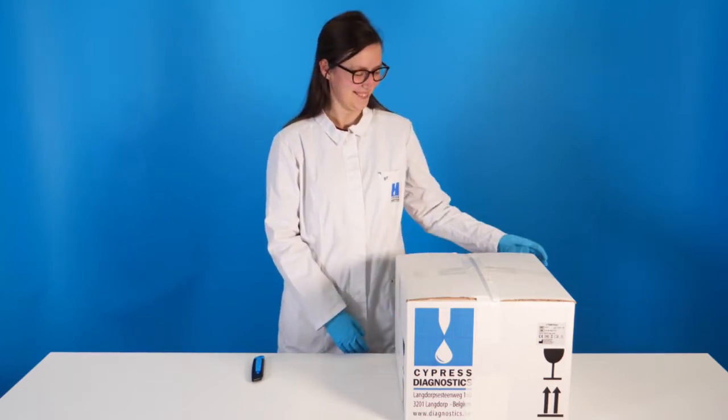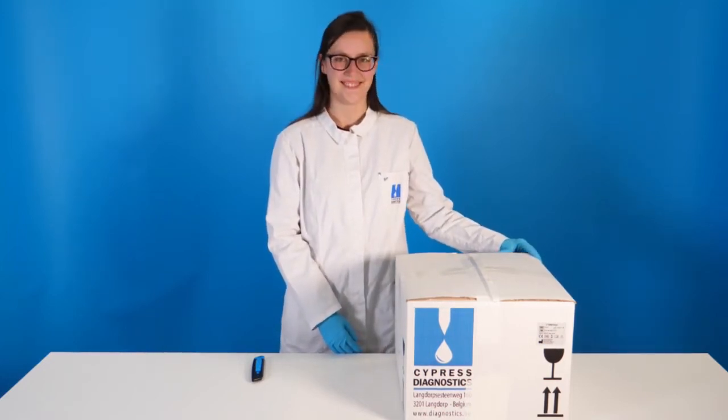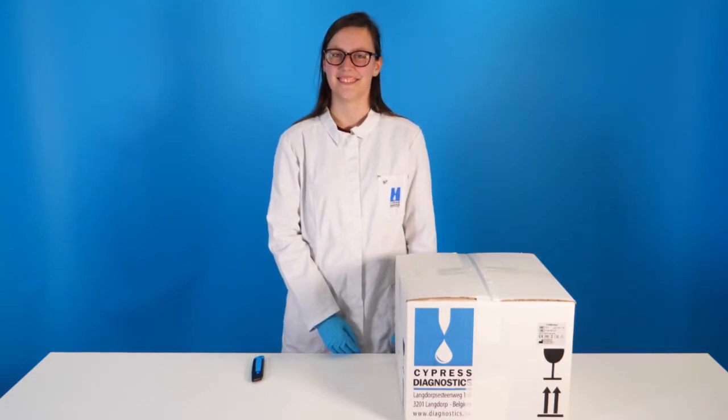In this video we present the CyanVision unboxing and installation. We have a separate video on the system configuration and software overview.